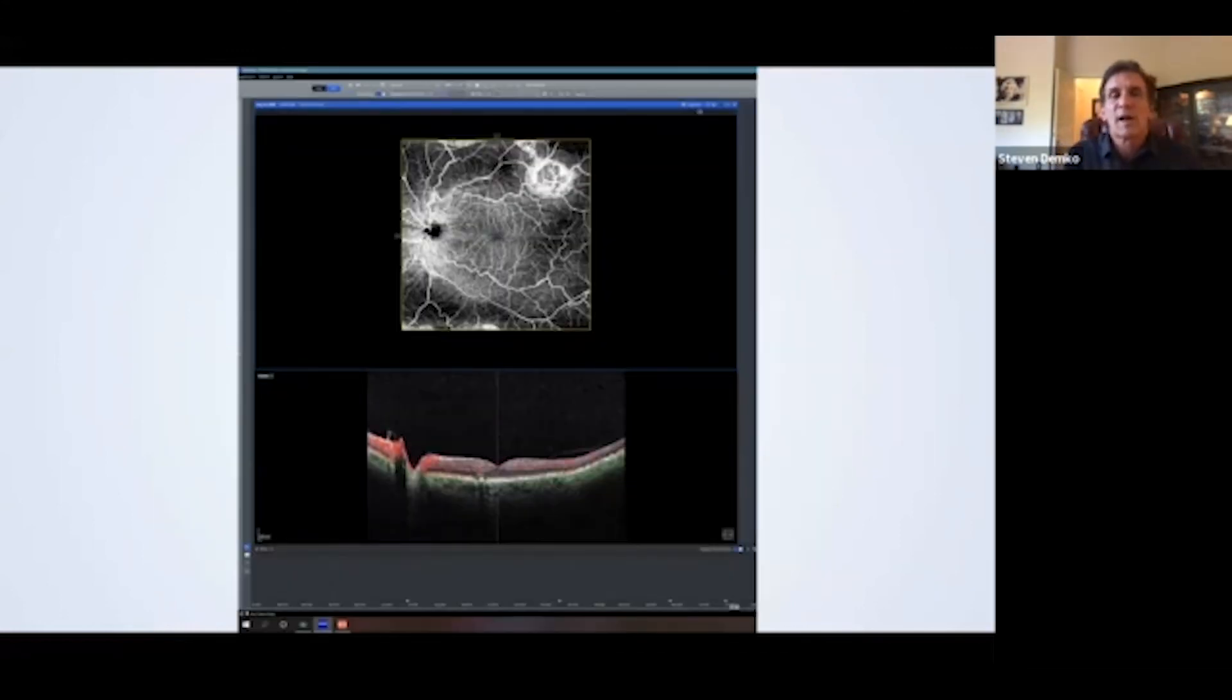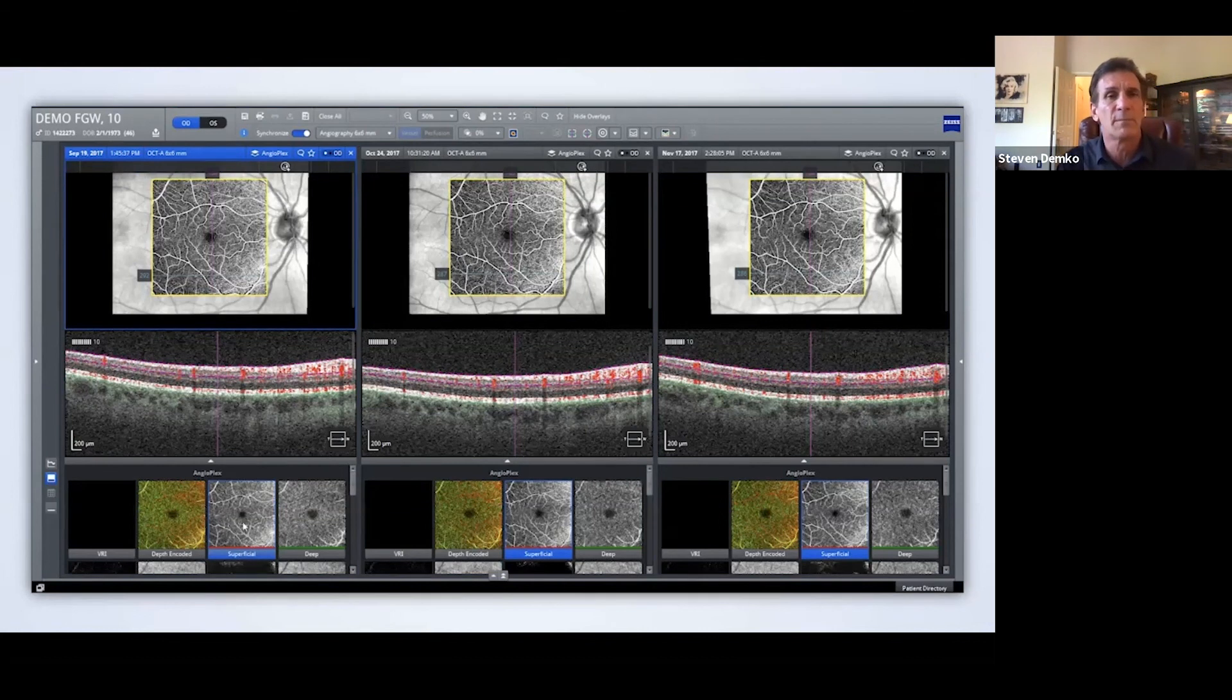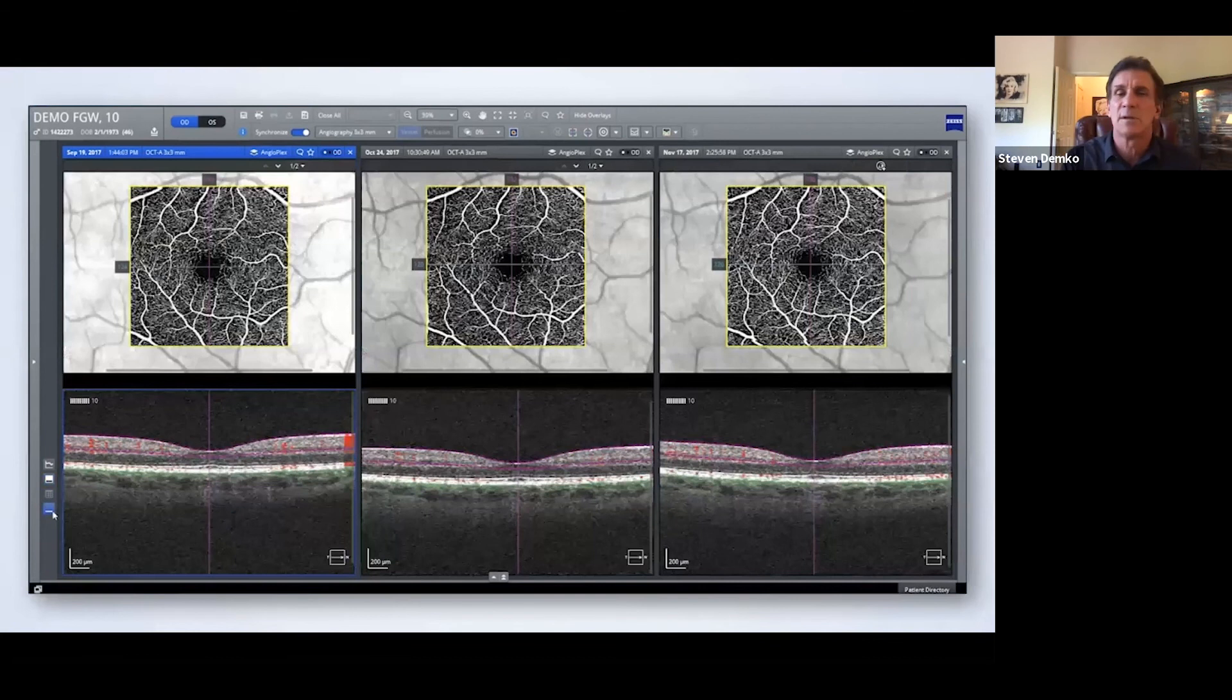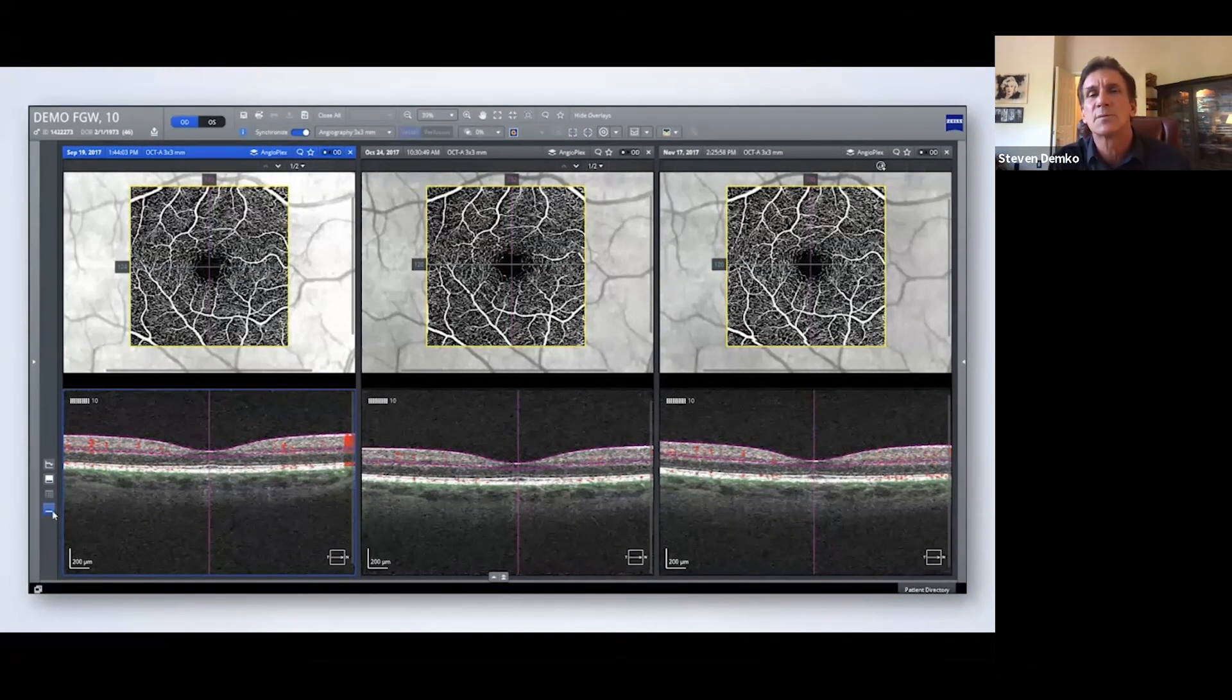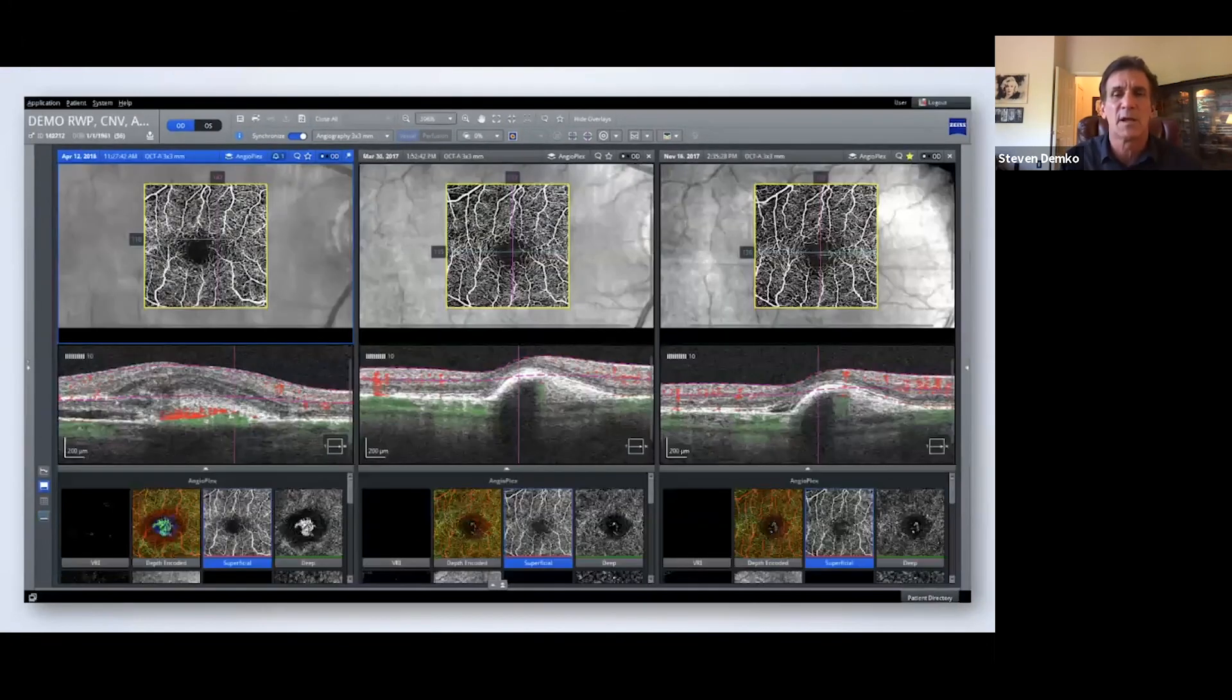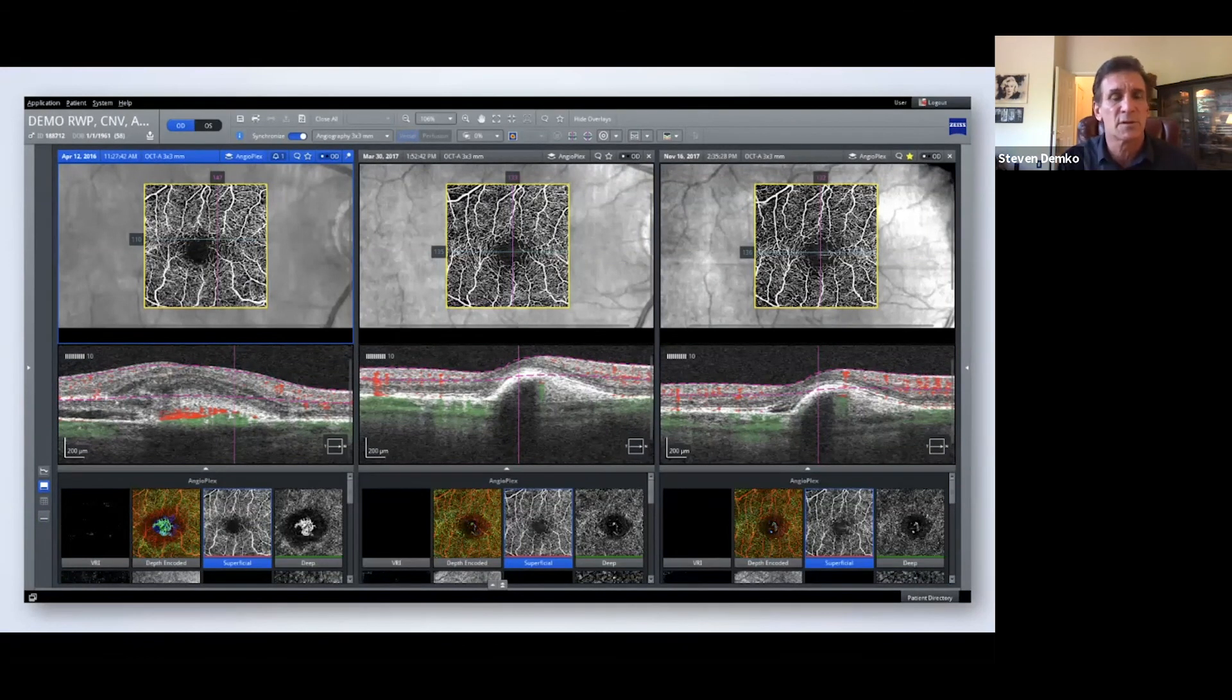I really want to show everyone how slick FORUM is. Here's some of the images that we overlaid using FORUM. So you can see an image of the retina with the angiography superimposed. And then you can see the layers of the retina below it. And then here you can see the, again, these images, and this is the first, second, and third image over the past three years of a person that has, well, actually this one here is all in the same year of different variations of the same eye with the diabetes and how the diabetes is progressing over time. And here's a person with macular degeneration and here's the angiography below the macular degeneration.